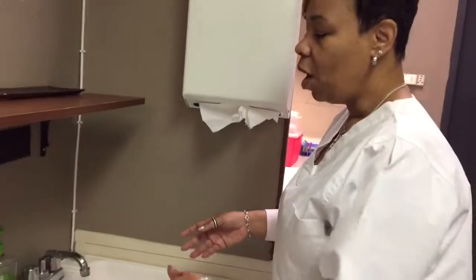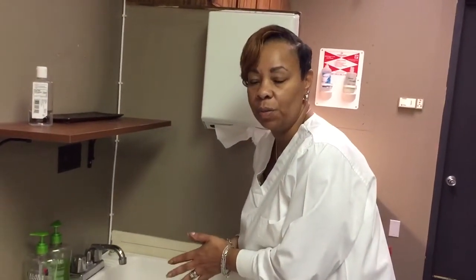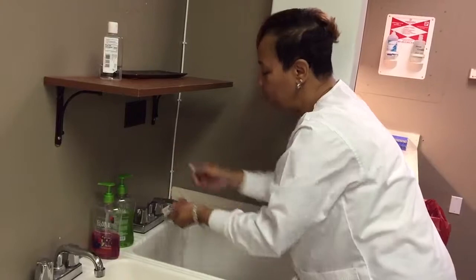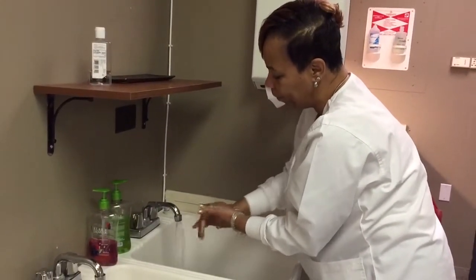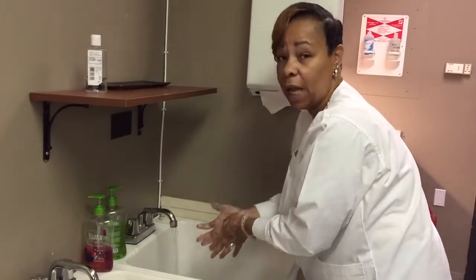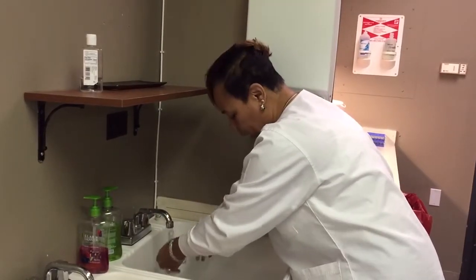My name is Kim Lewis, I am going to be your phlebotomy diva today. The first step that you definitely have to do before you even identify yourself to your patient is washing hands. We're going to wash our hands — medical asepsis. Make sure you get enough soap, wash your hands, create friction in a circular manner, go in between your fingers. You can sing the ABC song to time yourself.